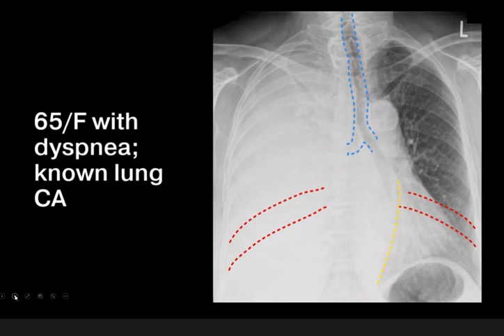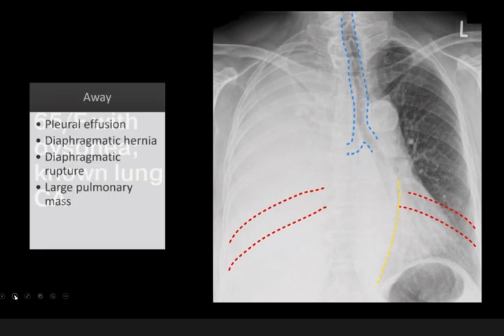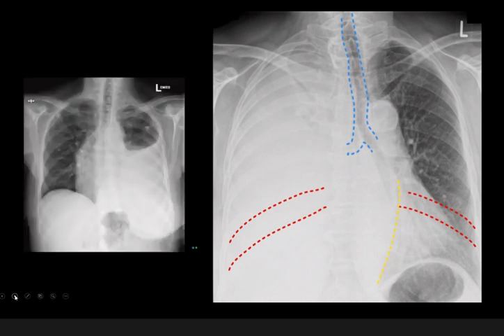And normally, when there are only small amounts of effusion, we have associated it with the classic meniscus sign, as in this case. But when effusions are very large, we may not see this meniscus sign, and it might just appear as an opacified hemithorax. Also, if patients are in the supine position, there is a redistribution of the fluid towards the dependent areas, and we also would not appreciate the meniscus sign. And it may just appear as a veil-like increased density over that side of the hemithorax.